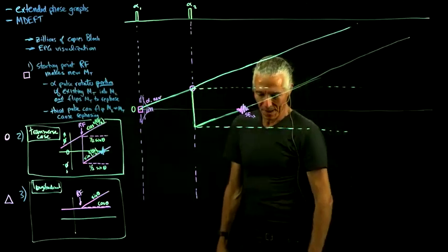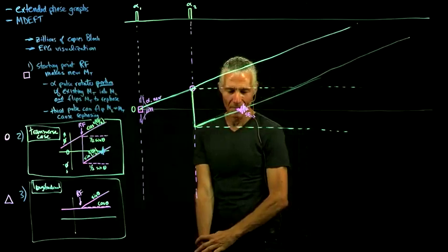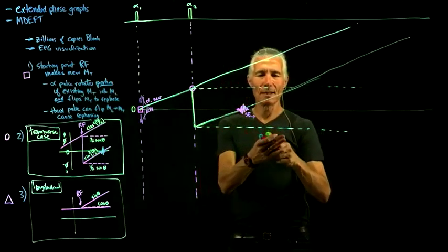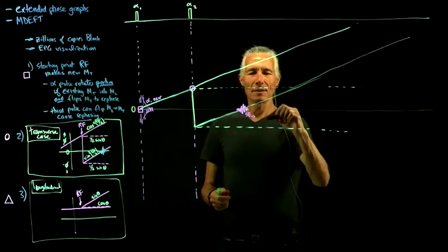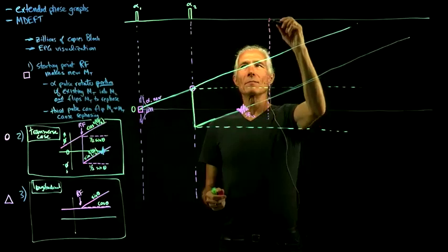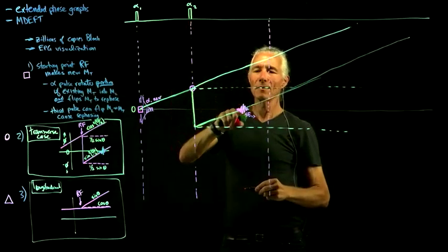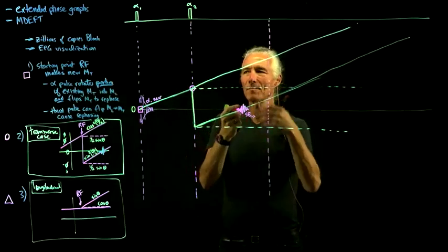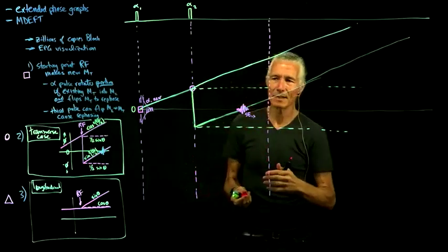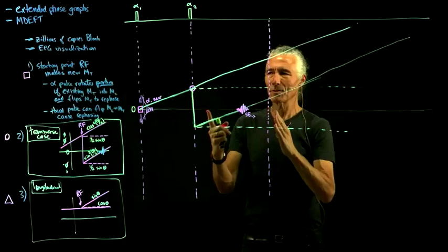So the mess that occurs is when we do another RF pulse. And so when we do another RF pulse, let's put that other RF pulse right here. You can see that we could put that other RF pulse exactly at the same space as this one, right on top of here, and then we would have sort of multiple pathways sitting on top of each other, which commonly occurs and is actually desirable to actually sort of pile the echoes on top of each other.